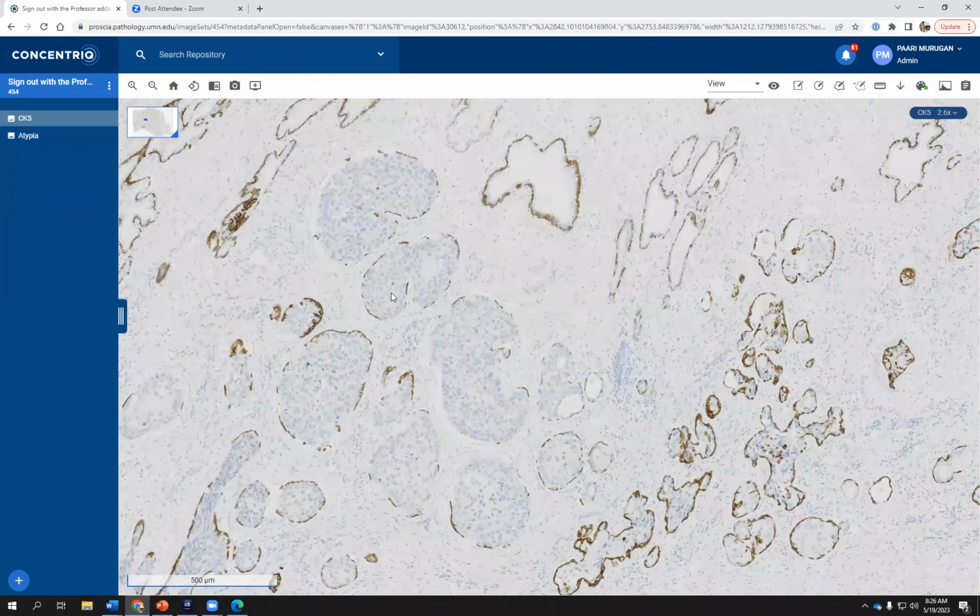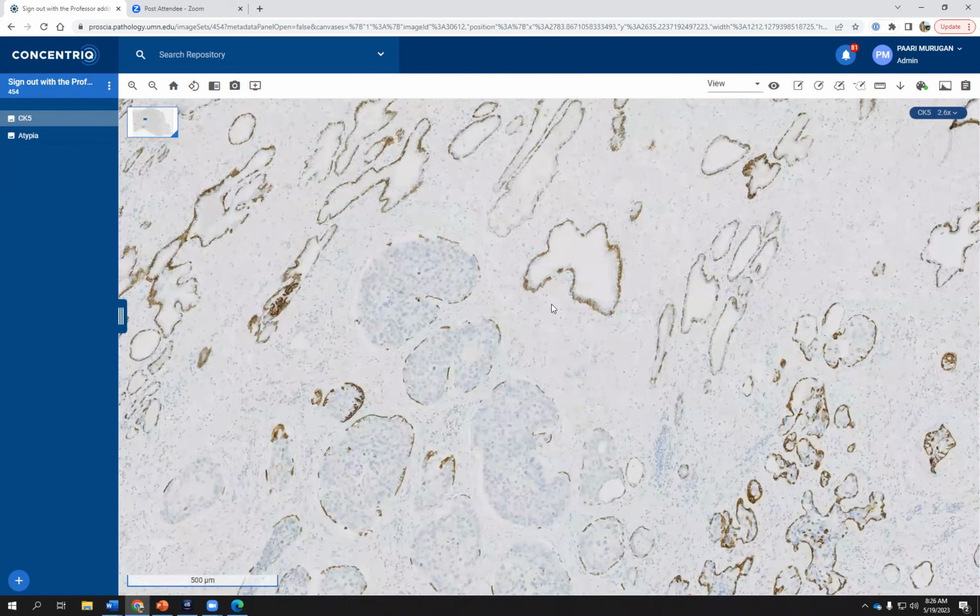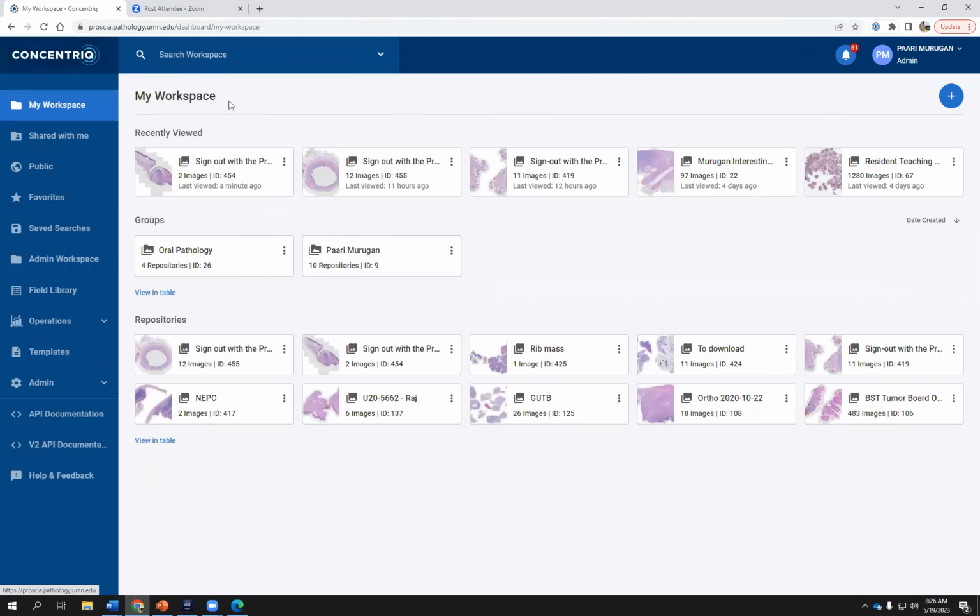Some of these immunostains are actually helpful in making the diagnosis of non-invasive urothelial carcinoma involving the prostatic glands and acini, which makes it still carcinoma in situ or CIS and not T2 or invasive urothelial carcinoma in the prostate. Okay, so that's the teaching point here that I wanted to show.